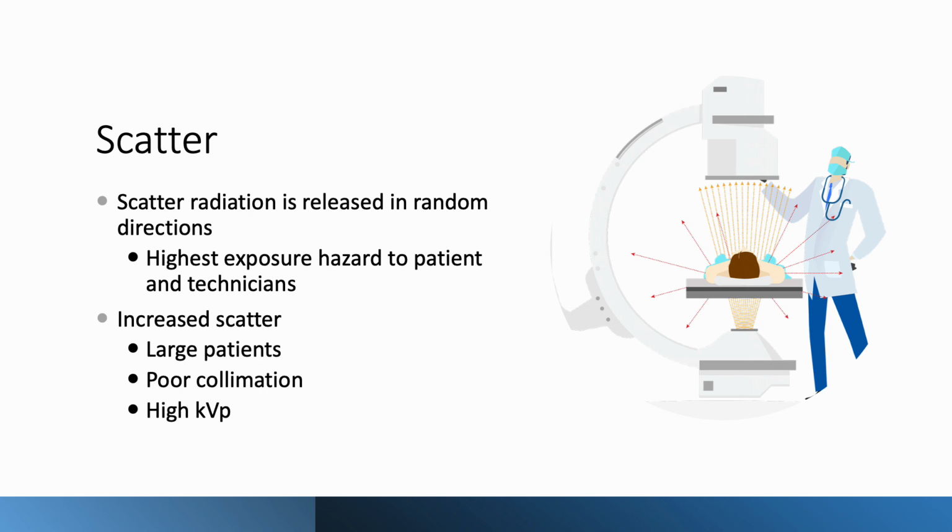Remember, scatter radiation is released in random directions. It's the x-rays that bounce off of our patient or bounce off of the table, and so they get projected outwards in all sorts of different directions. And these are the highest exposure hazard to the patient and the technician.